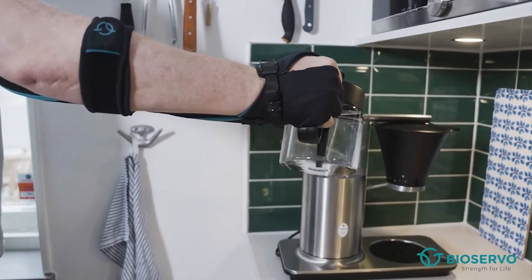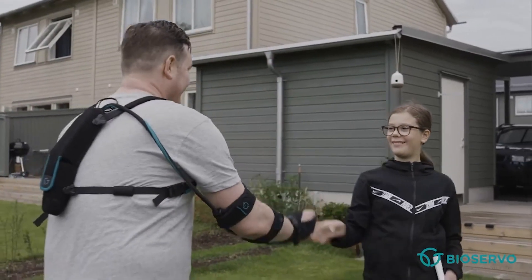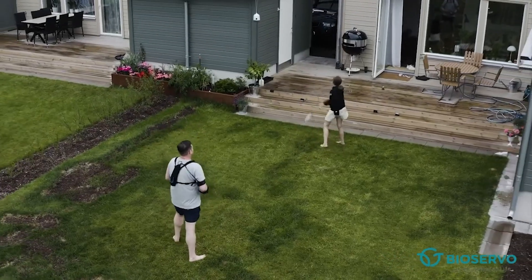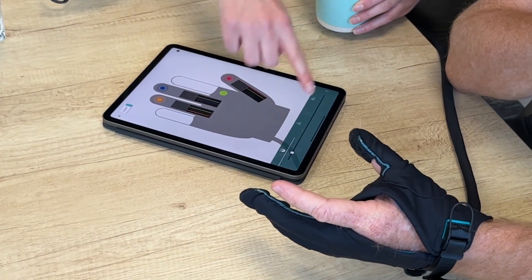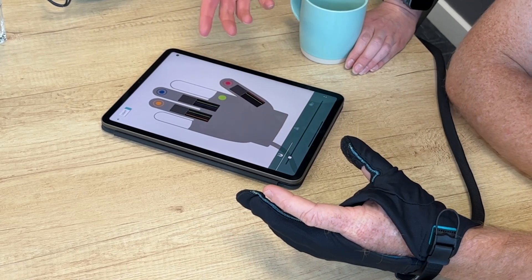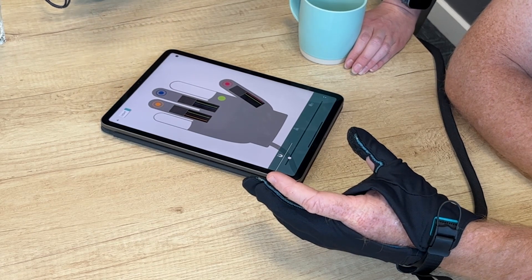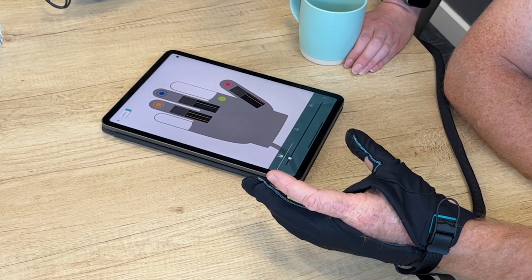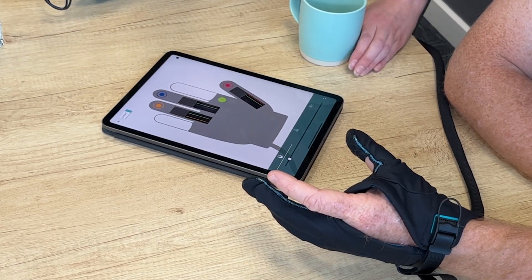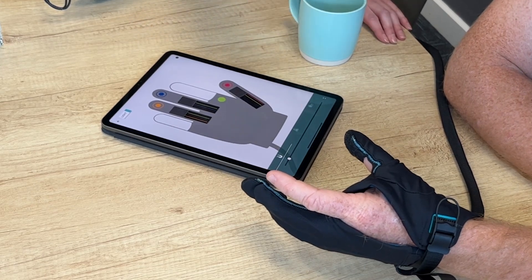Sports use is particularly popular — the way you grasp, release, and build endurance while playing golf is very different to doing tasks in the garden. On the app, there are three settings. The first, represented by a magnet icon, controls how quickly the grip initiates when you start a movement. For some tasks you might want greater intention before it starts grabbing, but quite a lot of the time you want it to be super rapid.